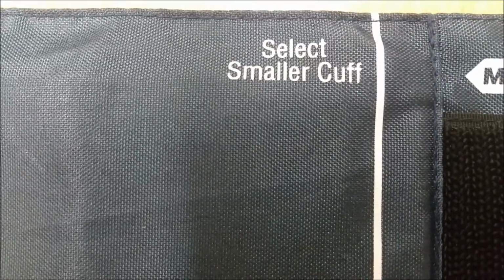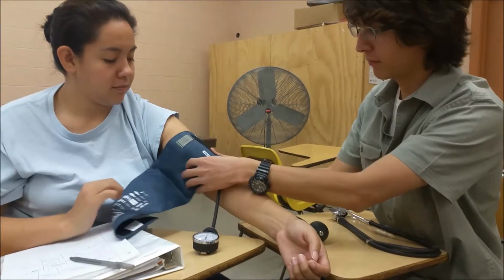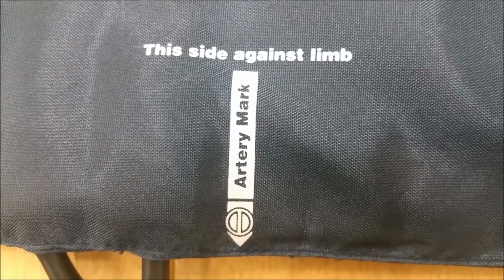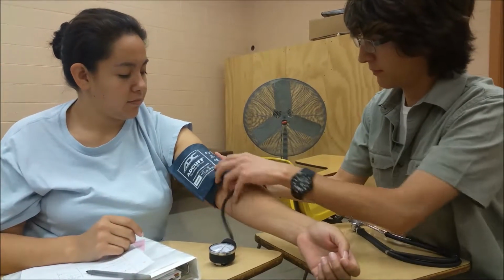Now, choose an appropriately sized cuff for the individual. Wrap the cuff around the arm at heart level and align with the brachial artery. There should be a marking on the cuff to indicate what part of the cuff goes with the brachial artery. The cuff should fit snug, not too tight, but not loose enough for it to be moving around.